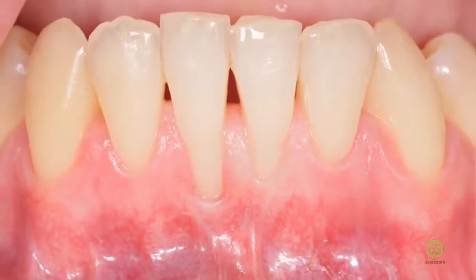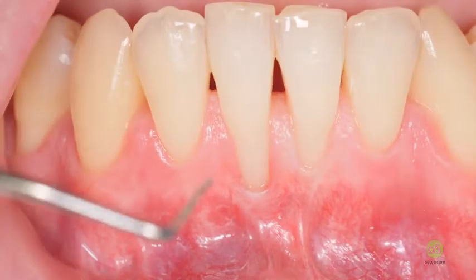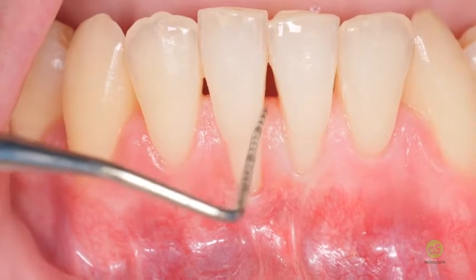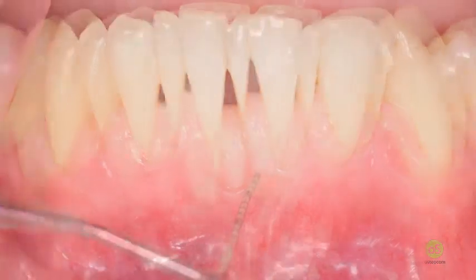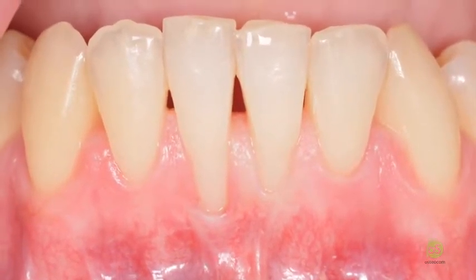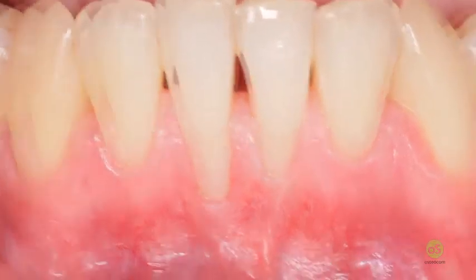But again, we will try to make fun of biology, as I will show you later, as we did yesterday, by extending the desepithelialization of this papilla a bit more lingually, and so being able to advance the flap, the surgical papilla of the flap, a bit more lingually, and making the connective tissue graft at the level of the cement enamel junction of the 2 teeth.